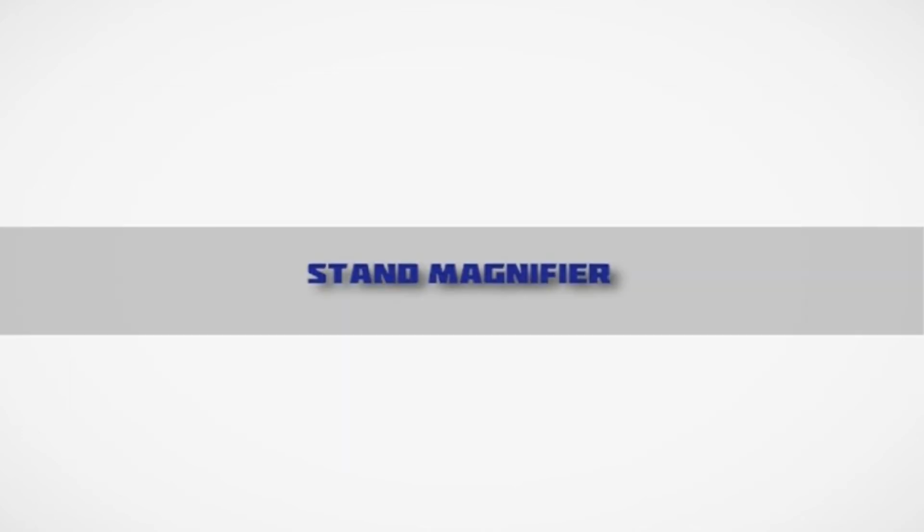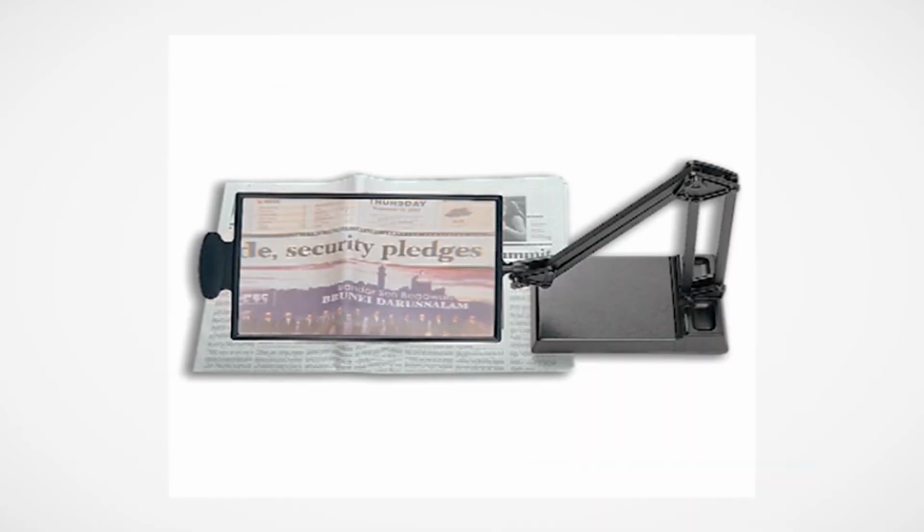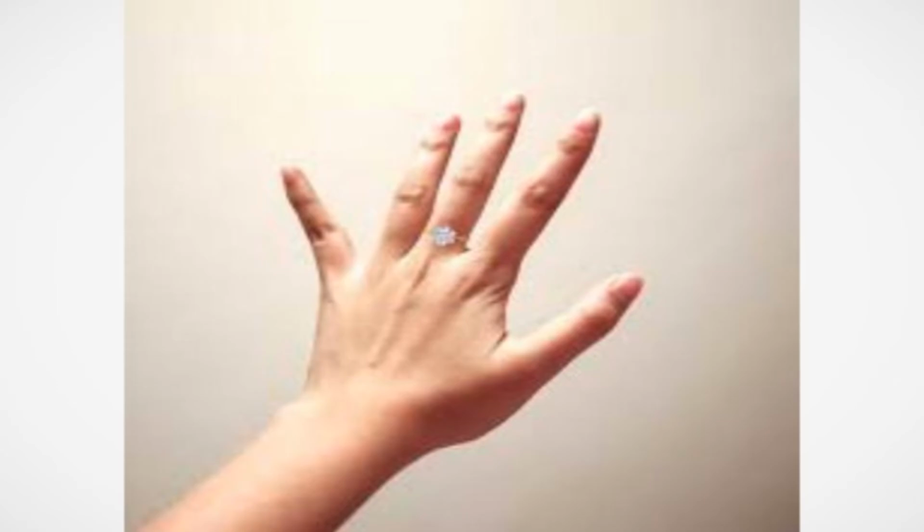Stand magnifier. Place the stand magnifier with the legs down flat on the page at the beginning of the paragraph. Move the head as close to the lens as needed to get a clear picture and the widest field of view. Move the magnifier slowly to the right while reading, keeping it flat on the page. At the end of the line, move the magnifier back in a horizontal movement to the beginning of the line. Move down one line. Start reading the new line. Fingers can be used as a help to locate the next line.